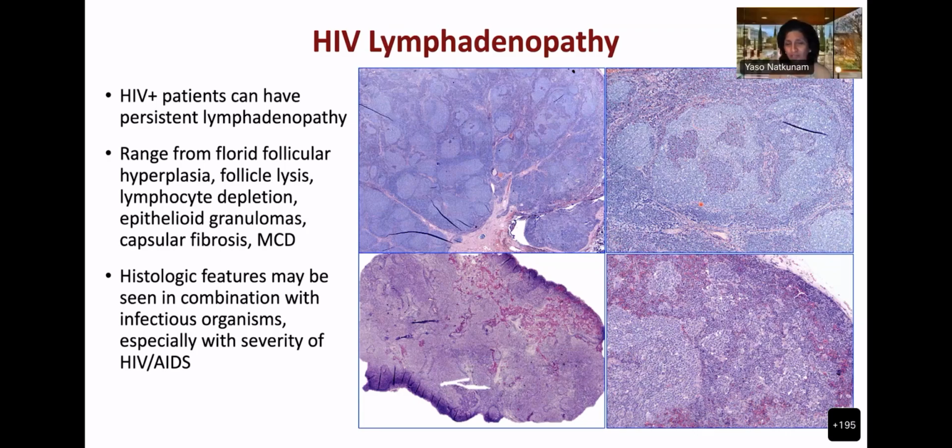And if you are not sure that you are seeing this, say, in a young patient, and you want to highlight it with immunohistochemistry, what marker would you get? Dendritic cell markers, CD21. Excellent. And what do you normally do? Is it CD21 or CD23? Which do you most often use? CD21. Okay, excellent. So great.